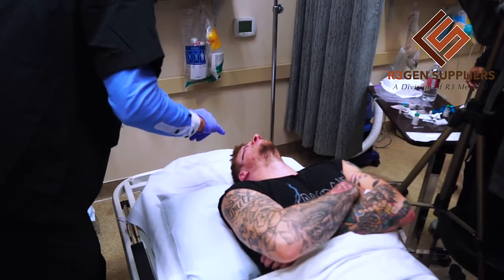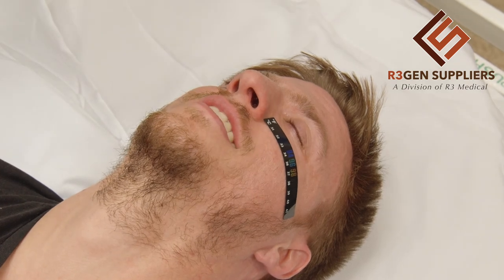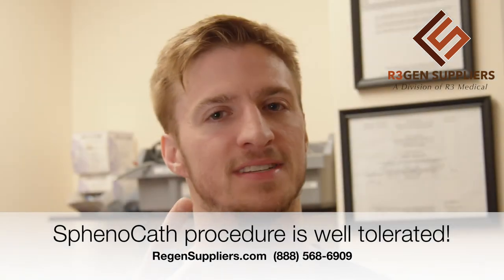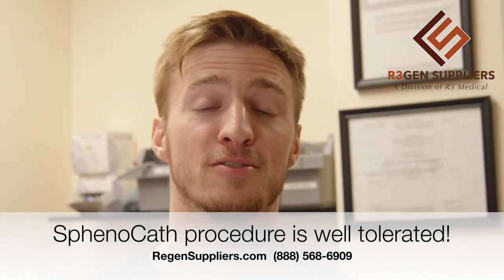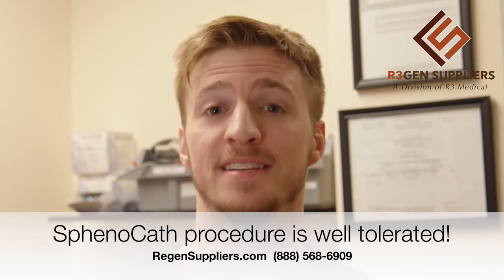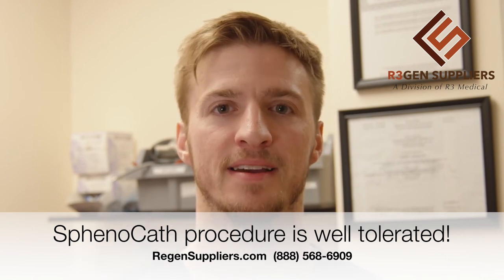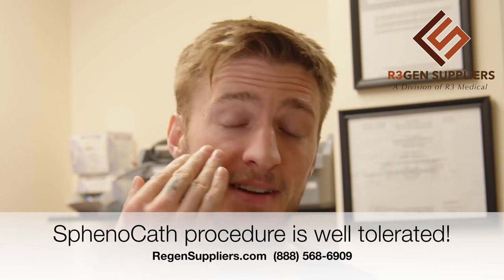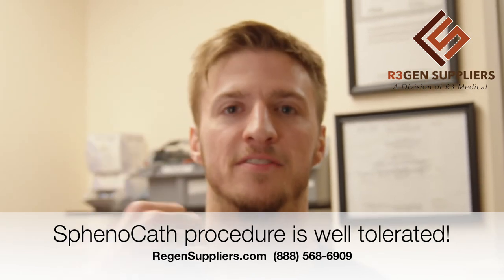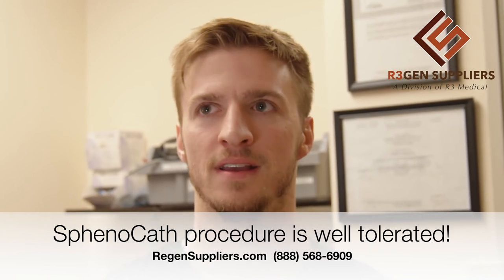You can see the temperature is slowly increasing on both sides — that's significant. So I just got the nasal procedure. When it first goes in your nose, it feels like someone is touching your bone inside your face. Once they release the fluid, it's a quick three-second burning sensation followed by heavy pressure, like someone pressing on your face. Then you just lay there for about 15 minutes. It's no pain — it's a three-second burn and then it's fine.